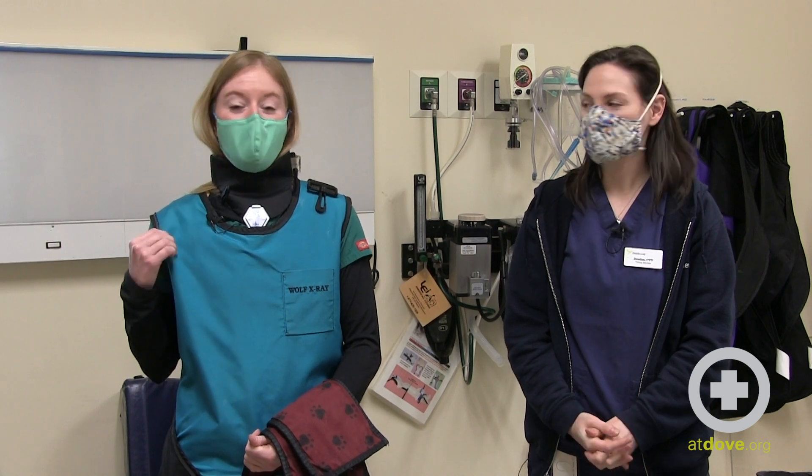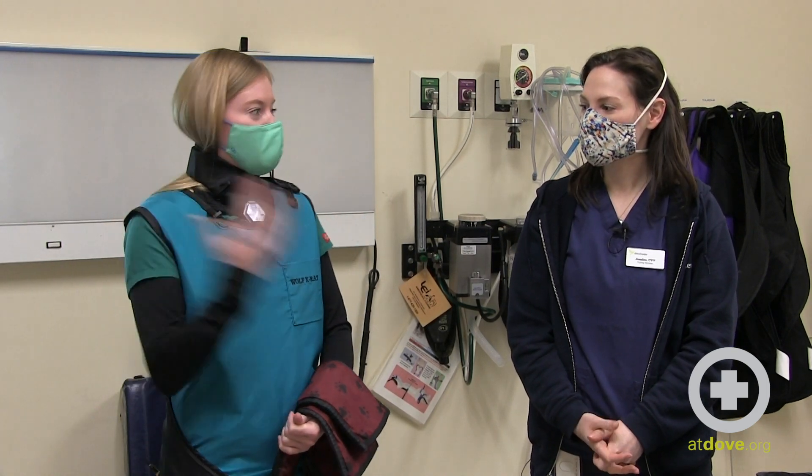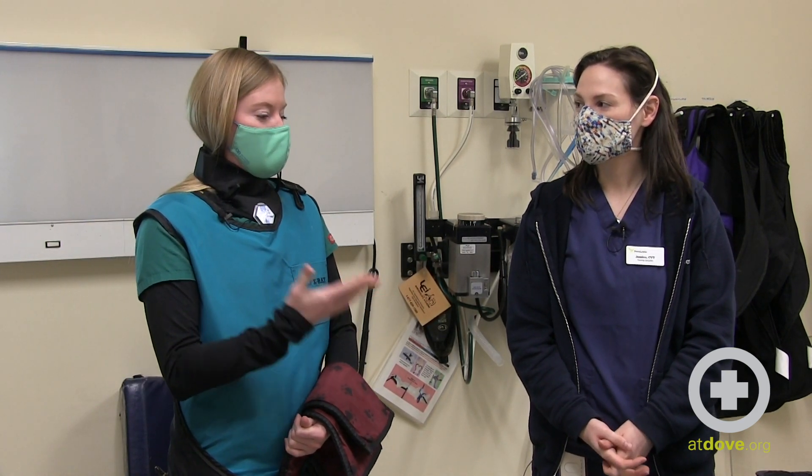Hi there, my name is Megan and today we're going to talk about the proper donning and doffing of your radiology PPE. My coworker Jess is going to demonstrate how to put on the gear, and then we'll talk about taking the gear off and the proper way to store it as well.